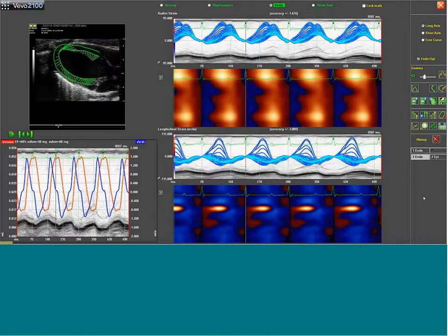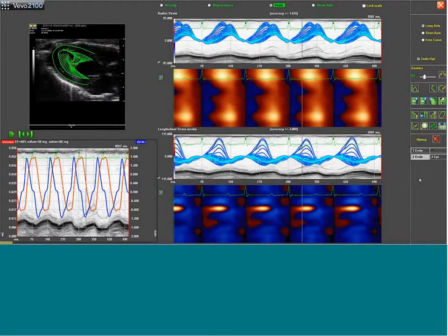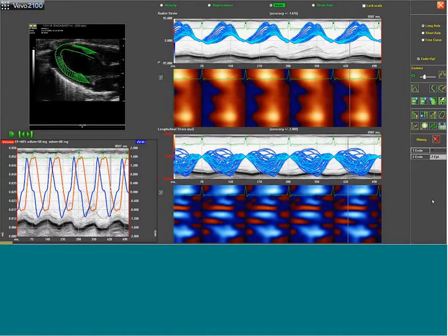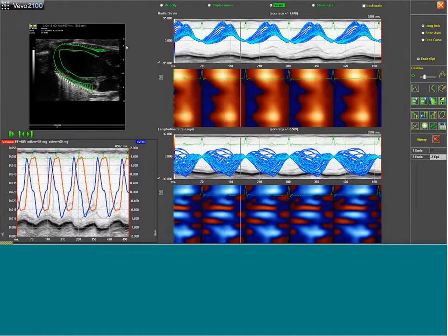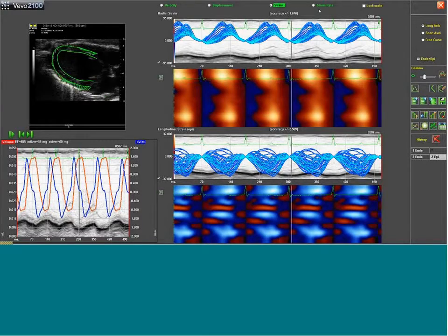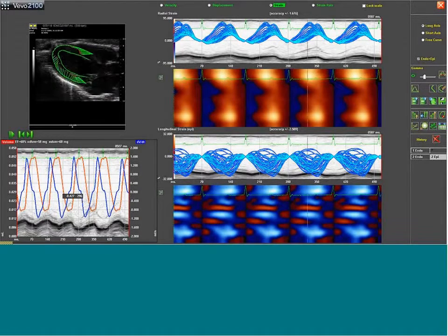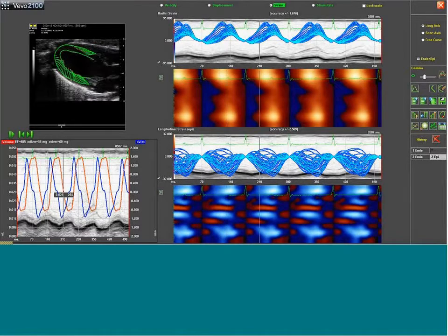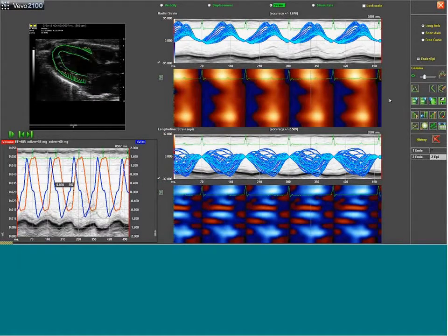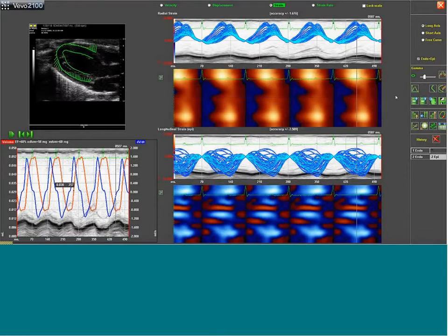In the tracing history, you can go back and edit a previous tracing or create a new one — histories accumulate there. You can also flip to the epicardium, where the vector points shift out to the epicardial surface. In the bottom left you have systolic and diastolic parameters, ejection fraction, LV masses, and change in volume over time. That's a quick overview of the main analysis screen. These data are all exportable — you can export AVIs, JPEGs, and CSV files of all the data.